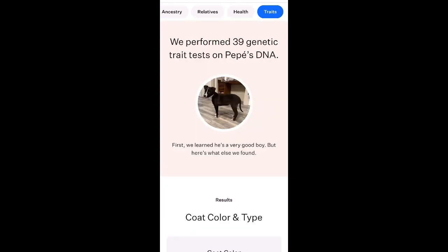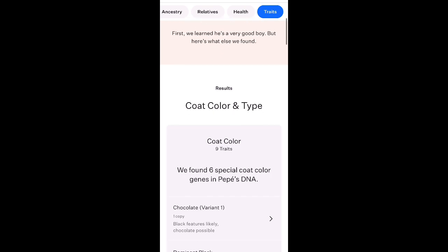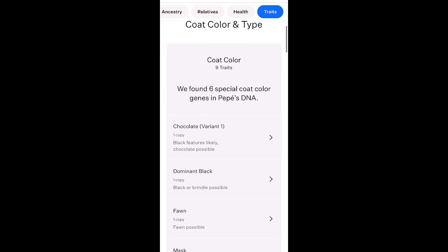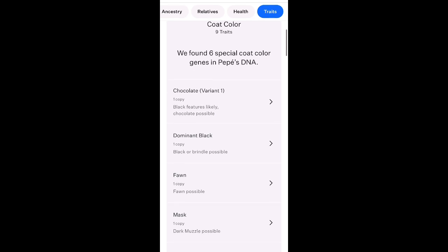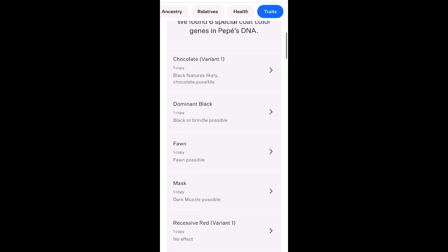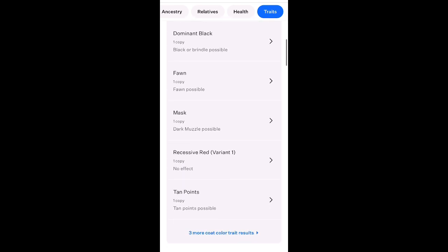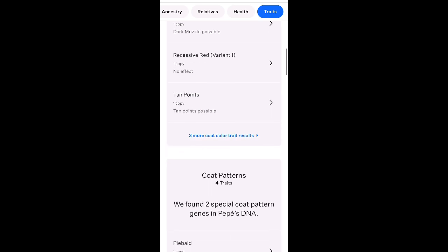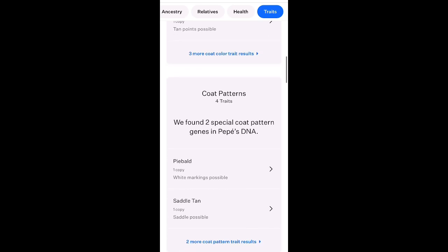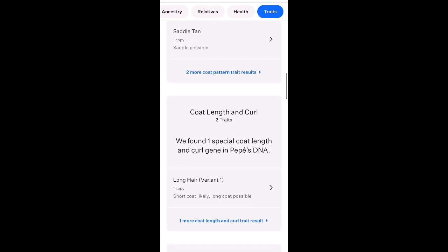And lastly, we have the traits tab, and I'm going to scroll down and explain what this is. It's basically genetic information collecting traits on Pepe's possibilities of appearance, aka physical features, and this marks down some traits that they found in his DNA that can be possible with his physical appearance.